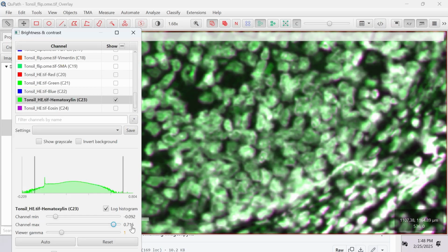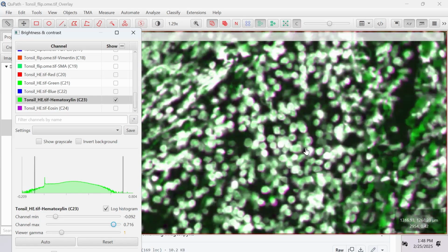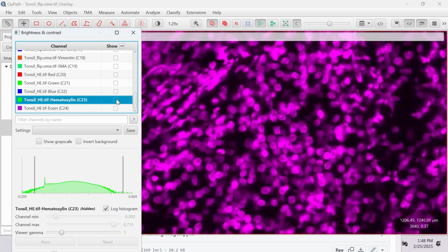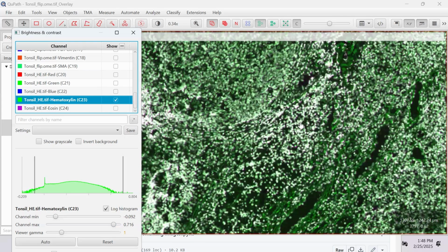So you have a compendium of knowledge in those videos and files. My conclusion from this is that it actually performed a pretty good alignment. My H&E based hematoxylin stain and my DNA stain from my immunofluorescence work pretty well, and they are pretty well aligned.